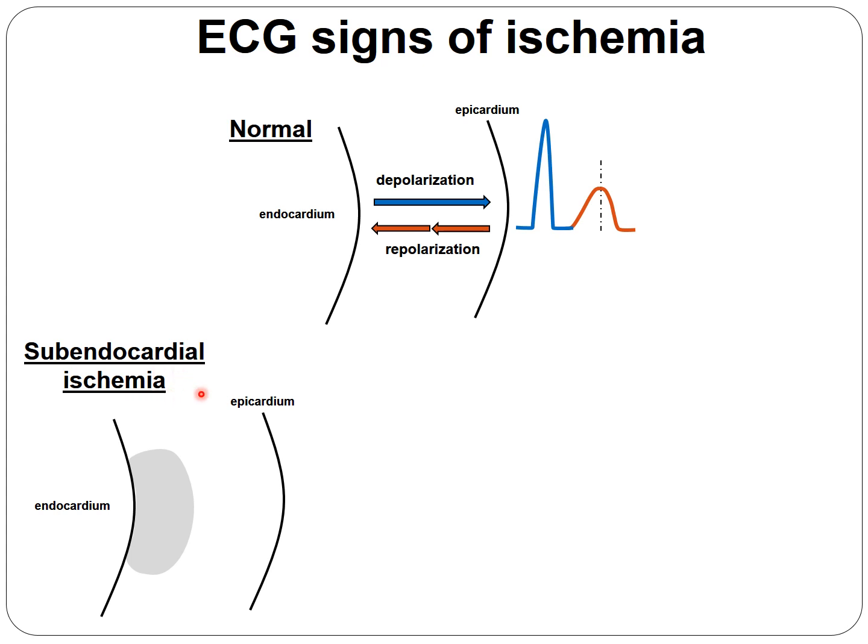What will happen when we do have a subendocardial ischemia? Every vessel, every coronary, is passing the myocardium from the epicardium to the endocardium. So the endocardial area is the most affected, the least supplied with oxygen. During contraction, the blood supply or circulation in the endocardium is almost zero, and some oxygen can only diffuse from the chamber of the ventricle to these areas.